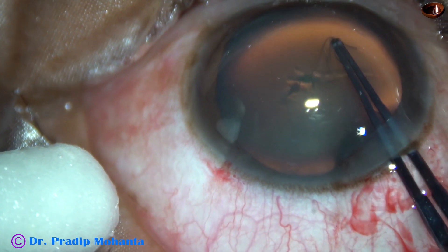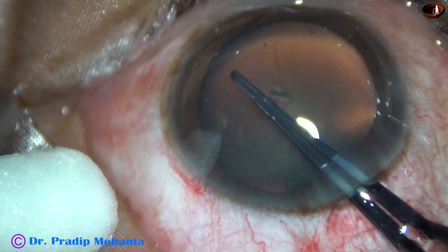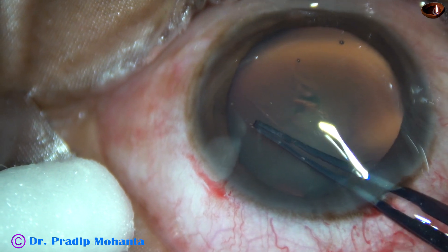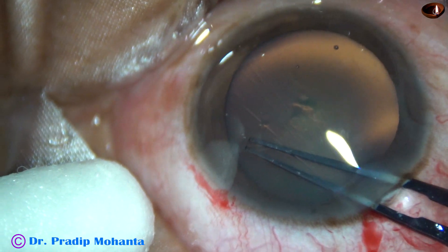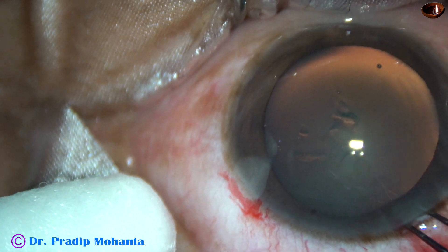Now here, some amount of visco came out, and the anterior chamber became shallow. From this point, it tends to go to the periphery — and here it goes. At 2 o'clock, it has gone to far periphery, and I could not retrieve it.